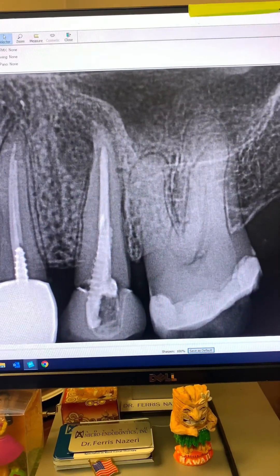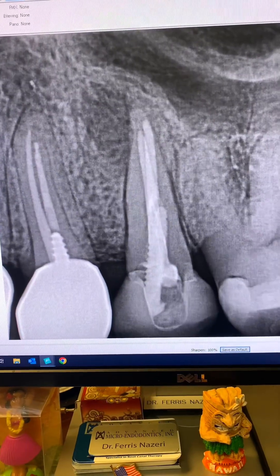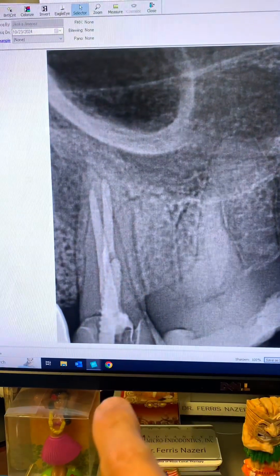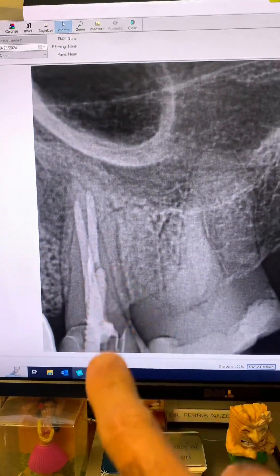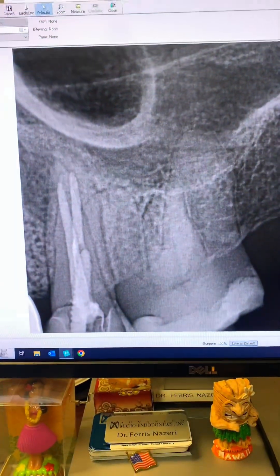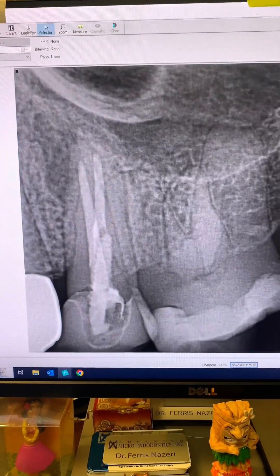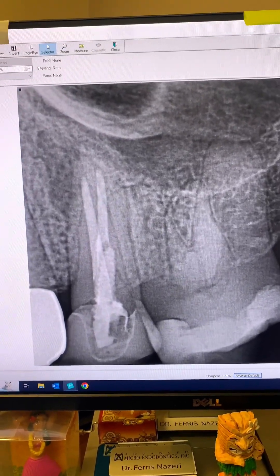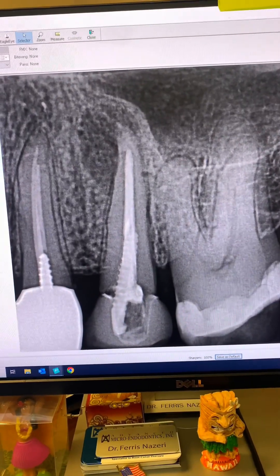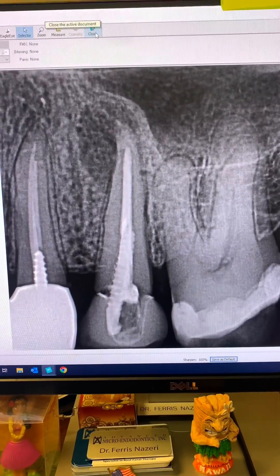So let's open this tooth up. This is another angulation of the tooth, and this is yet another angulation. Again, you can see the prefab metal post and two canals here, and the periapical lucency there. And this is another angulation. When I examined the tooth, it was slightly tender to percussion.